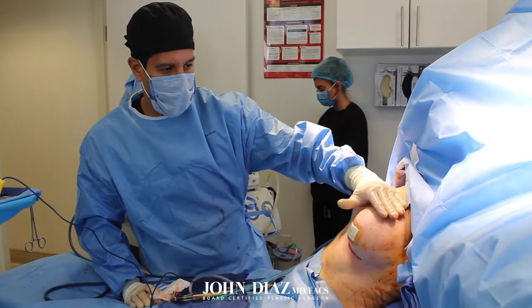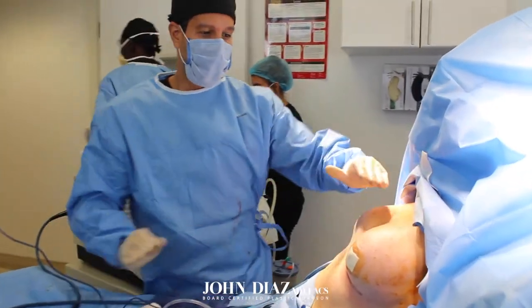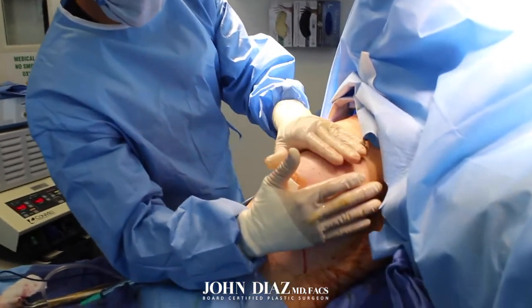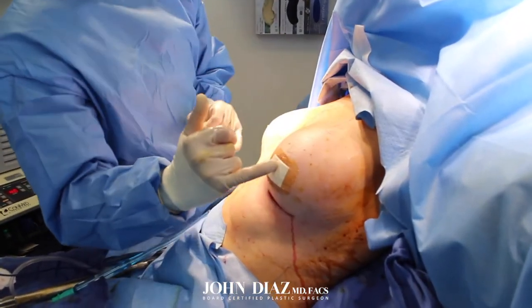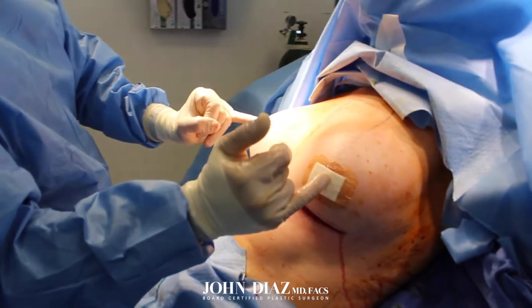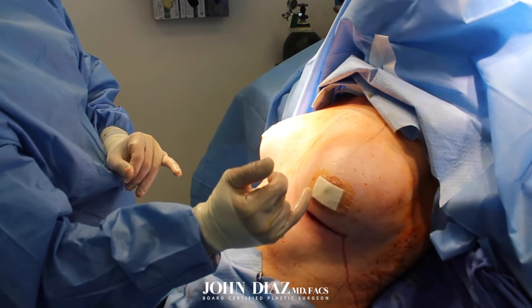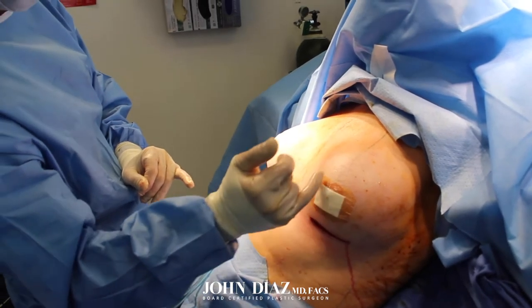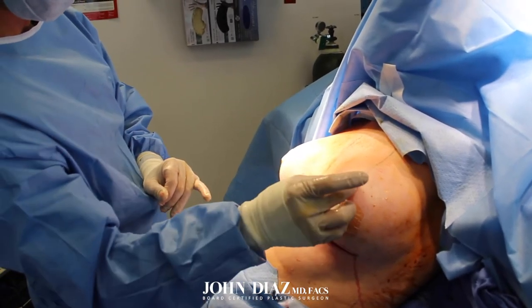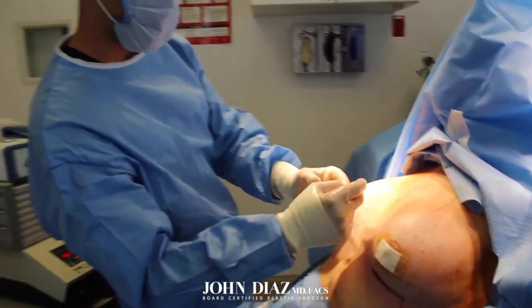I've just finished putting in the implant and Strattice on the left side. The breast has a very nice, beautiful, soft shape. However, the nipple positions are very off and very asymmetric. So the last step is to perform a lift — what's called the circumareolar or donut lift — to raise this nipple more and raise the other slightly, so that they match and have better symmetry.